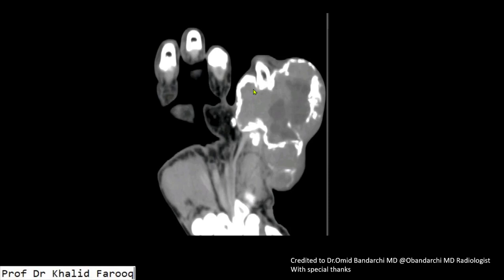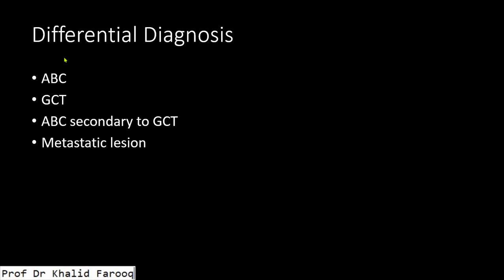On CT examination, we can see the medullary filling is preserved while an expansile bony lesion is appreciated involving the entire body of the proximal phalanx. We can see multiple variable-size necrotic areas in it, and here we can see there is a solid component of the lesion.